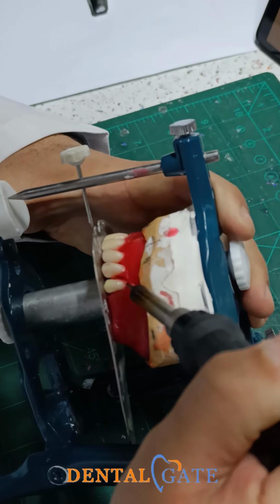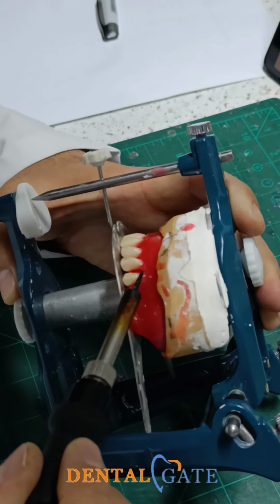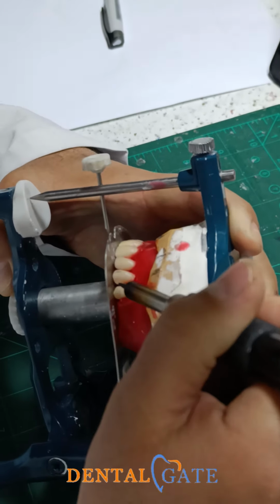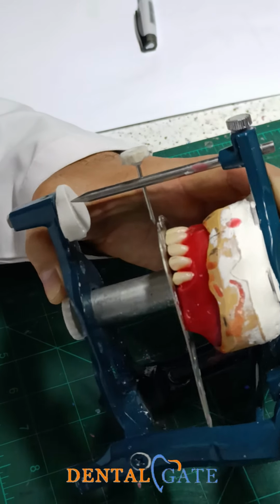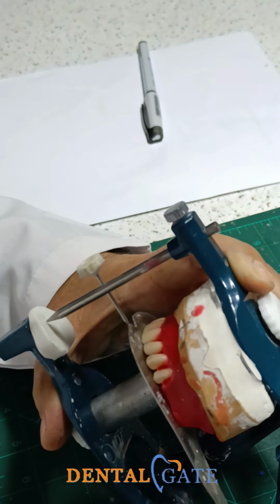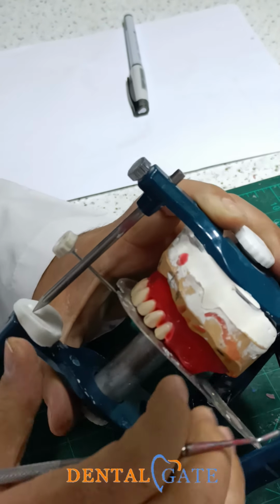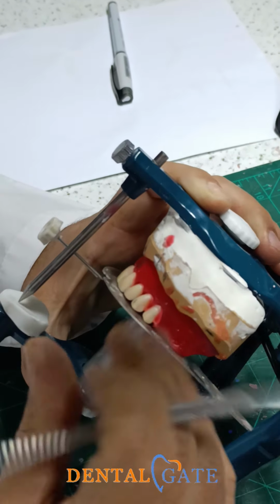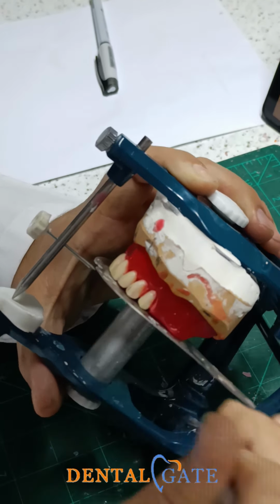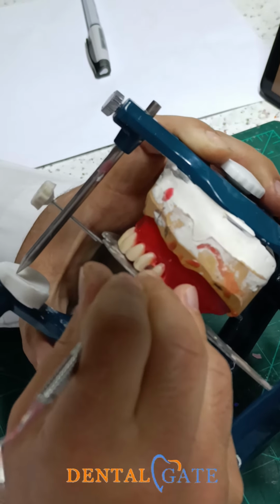Many criteria should be established to produce the curve of Wilson, because the lateral movement of the mandible can be performed within this curve. We have a horizontal curve, we have another one, yes, curve of Spee, that will compensate, the compensating curve in the complete denture, and curve of Wilson. So just make a contact with the lingual and don't make a severe space at the buccal one.